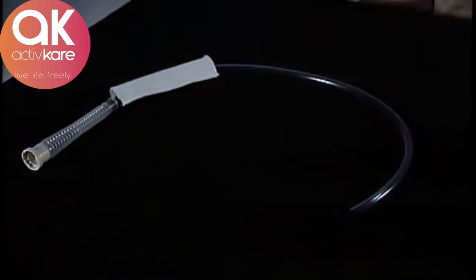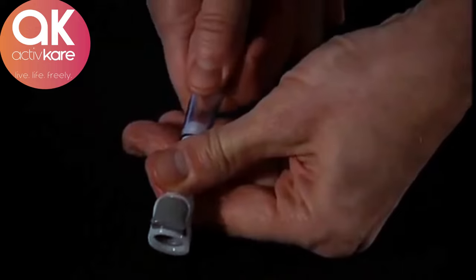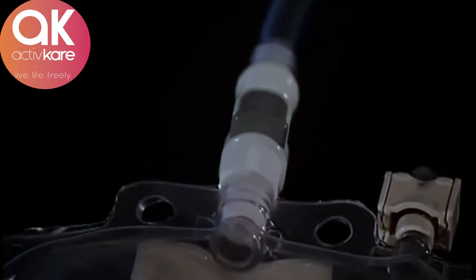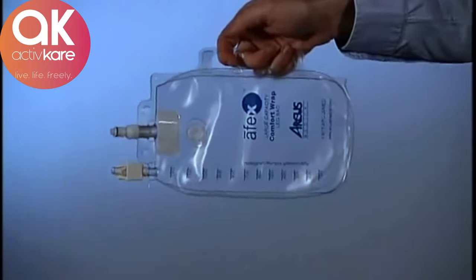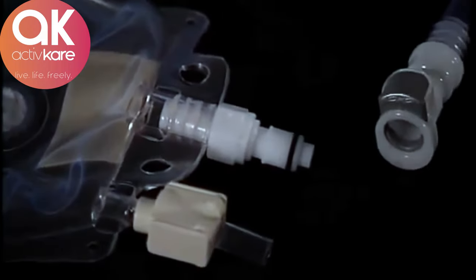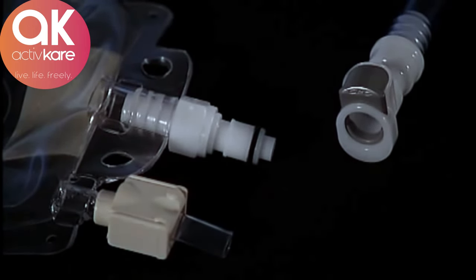The tube assembly attaches to the receptacle with the same turn and click design. To assemble the extension tube, determine the correct length required and cut it with ordinary household scissors. Then push in the upper quick connect coupler. To connect the tube to the bag, simply push them together until they click. To disconnect, push in the gray metal tab on the upper coupler and pull apart. Use the convenient built-in handle to easily drain the bag. These couplers have an auto-shut-off feature, which prevents dripping when disconnected, so there's no worry about leakage when draining the bag.